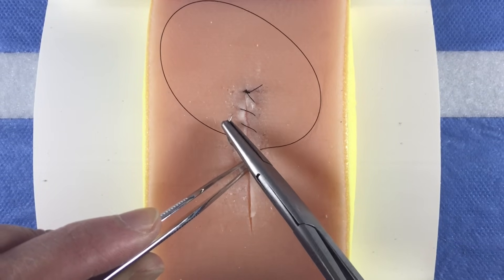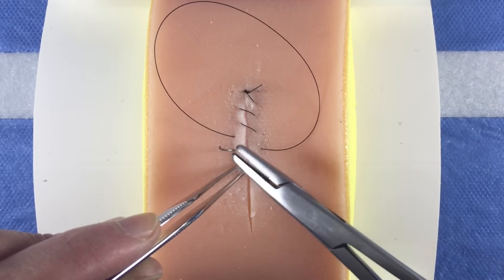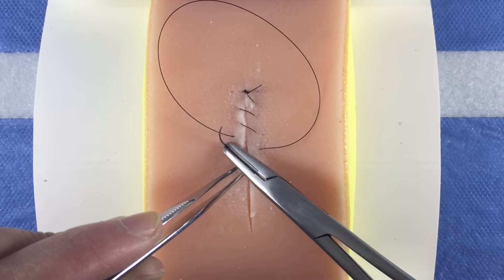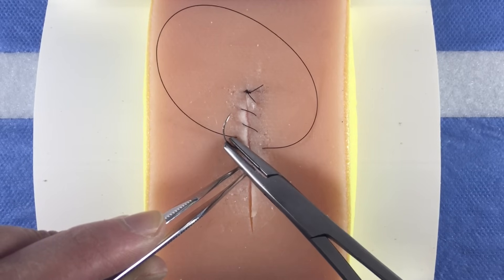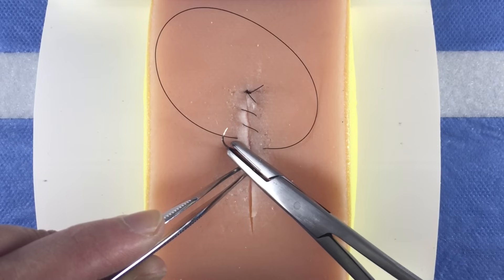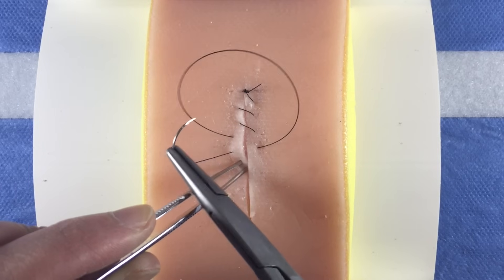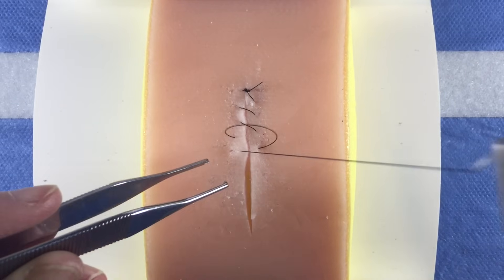Advance the needle through until two thirds of it is through the skin. Then, with your needle driver in the pronated position, grab the needle directly at the skin level, ideally at an angle so as to optimally load it for the next bite. Rotate the needle driver in your hand and take the next bite.